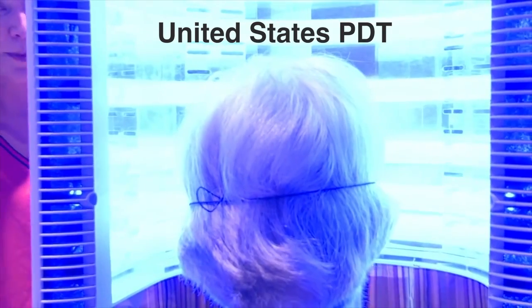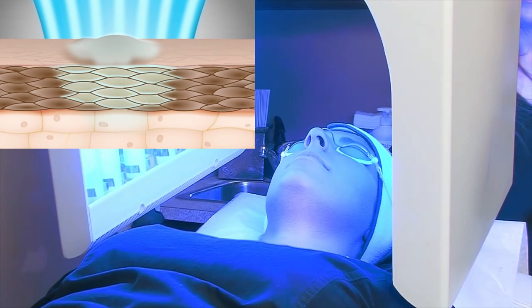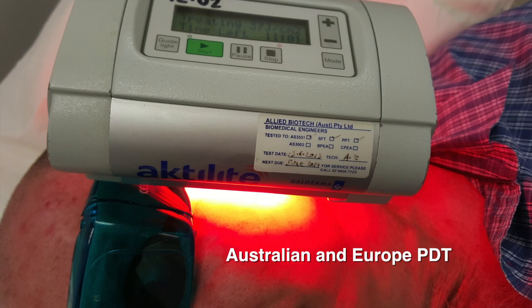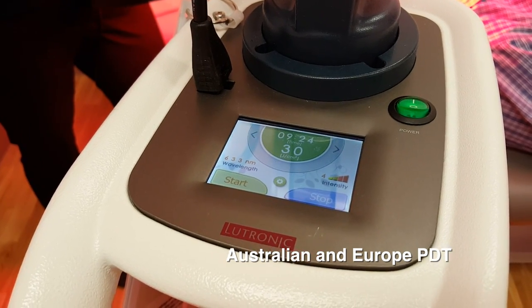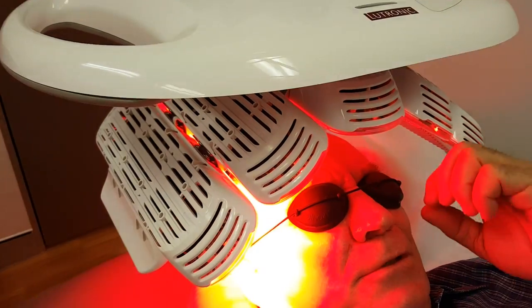Step 4 is activation and illumination. In the US, blue light is used. The blue light activates the chemical ALA, which is concentrated in the pre-cancer cells, causing cell death through oxidation. Red light is used mostly in Europe and Australia. There are two absorption spectrums — blue and red. Red goes deeper, it's more painful, but equally as effective as blue. This is red light treatment activation with PDT.